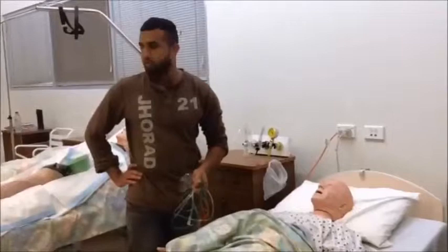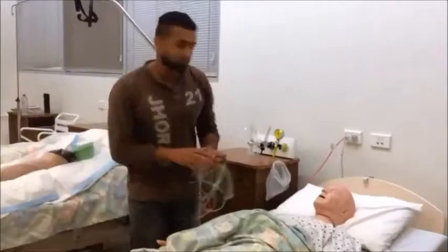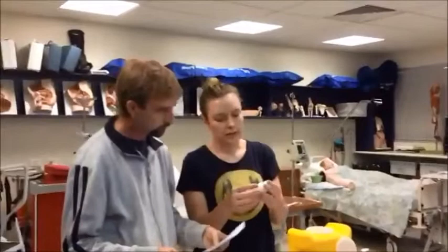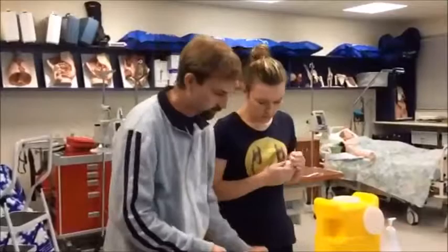Temperature is 36.5. So everything is pretty much at a good level — it's just the oxygen level that needs attention. I'm going to put the oxygen on — we've got an engine in here. Mr. Weillow, we're going to put it on so you can breathe a bit better and bring the oxygen level up. Does it feel alright? Can I put it on? That's fine.